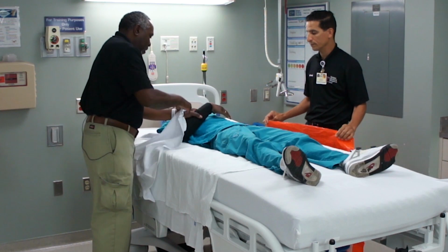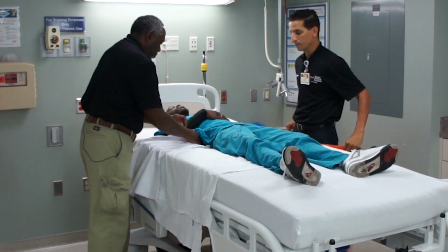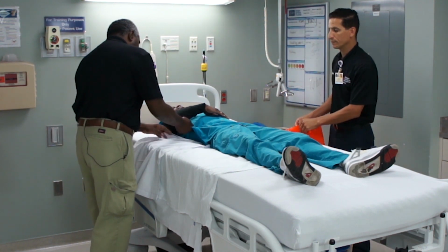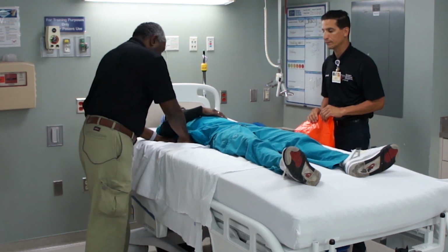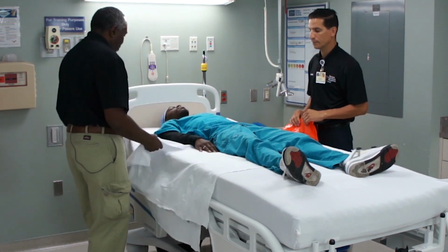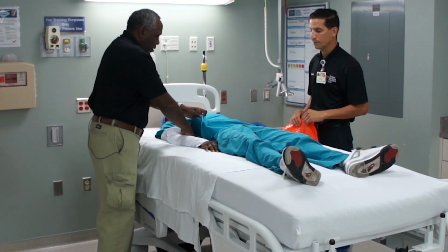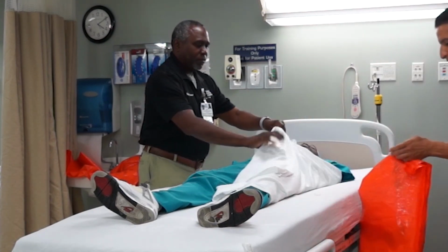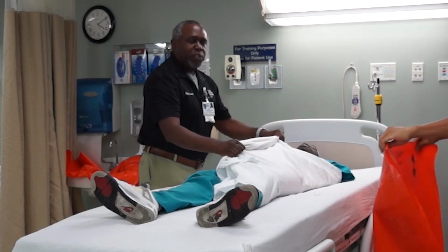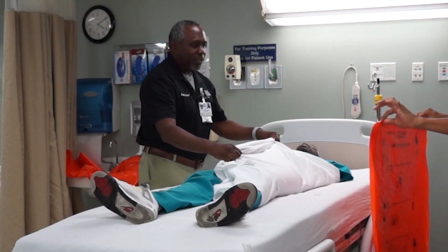So I'm going to go ahead and get the pillowcase underneath the patient's torso. As I said, this is just to secure the arm and prevent it from being caught. So it goes under, over, and under again. On this side, we're going to take the draw sheet and fold it over some. I'm not manually turning the patient, I'm just providing a hold here so he can place the Z slider underneath.